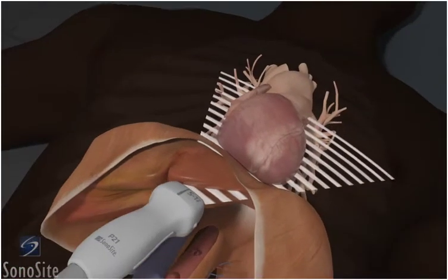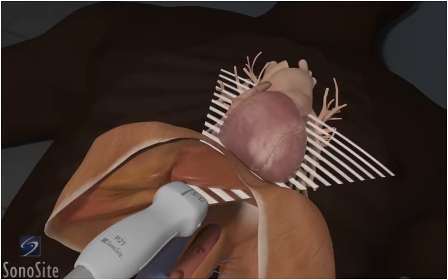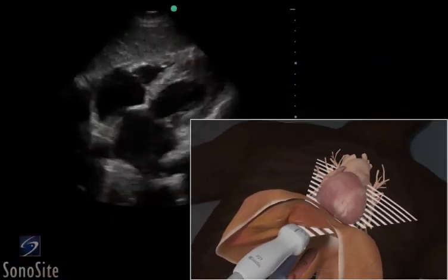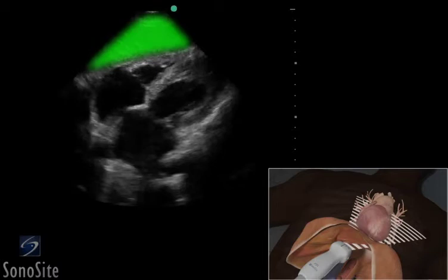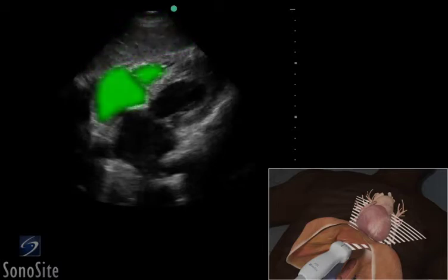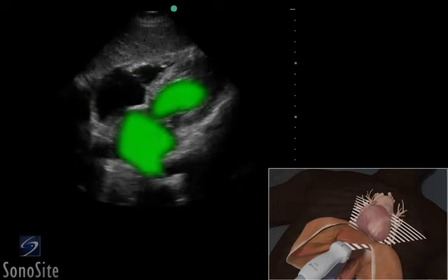Having the patient bend their knees helps relax the abdominal wall muscles for better transducer positioning. The first structure seen closest to the transducer is the liver. The right side of the heart will appear closer to the transducer than the left side of the heart on the ultrasound image.